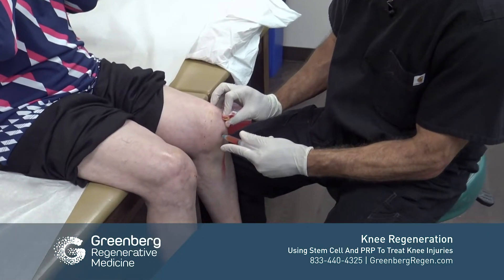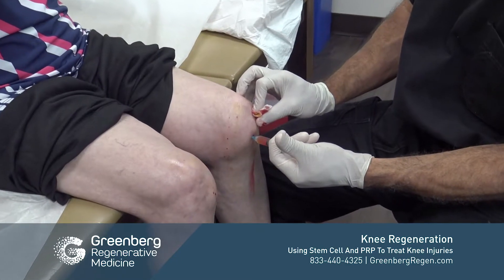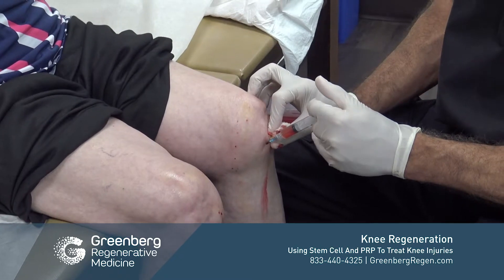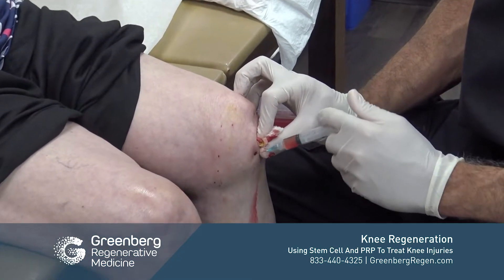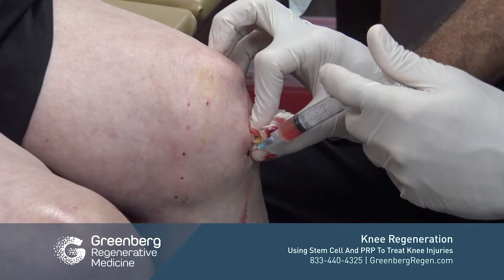Here's the stem cell mixed with PRP that we're injecting into the medial portion of the knee. Since her arthritis is more on the medial side, we're going to concentrate more of our cellular products there.